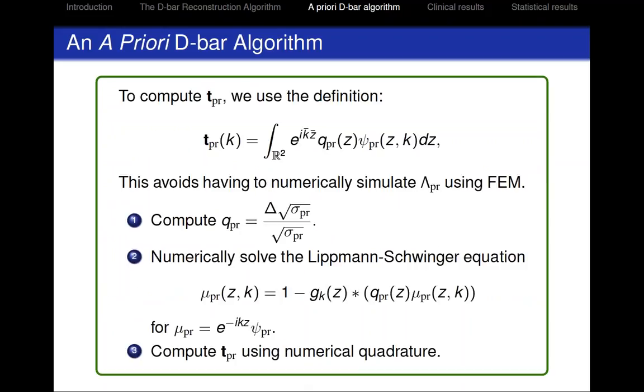Yeah, but also a question on the previous slide. You say we numerically solve the Lippmann-Schwinger equation. How is that done? We use a multi-grid method. Well, it's just two grids, a fine and a coarse method, and you don't even have to use the grids. But the key to it is here you have this convolution. If you take FFTs, you can change this convolution to a product. So we use FFTs on this piece, and then IFFTs to go back. You just hit this thing with the FFT, compute the product in the Fourier domain, and then IFFT back on a grid.